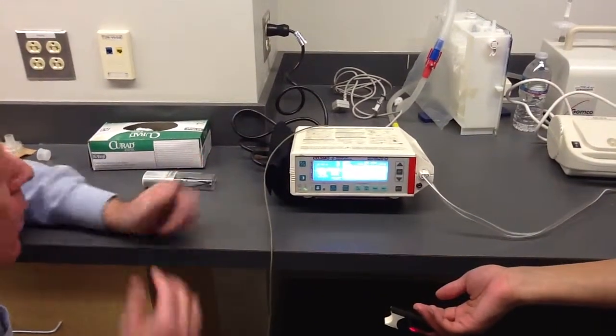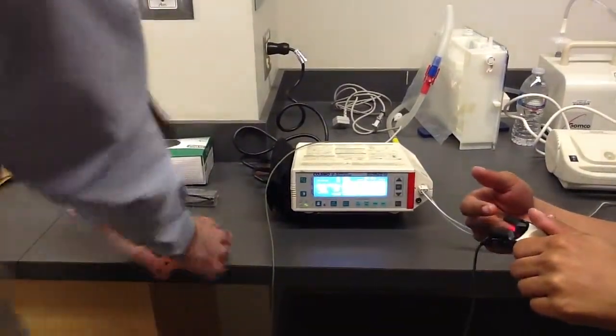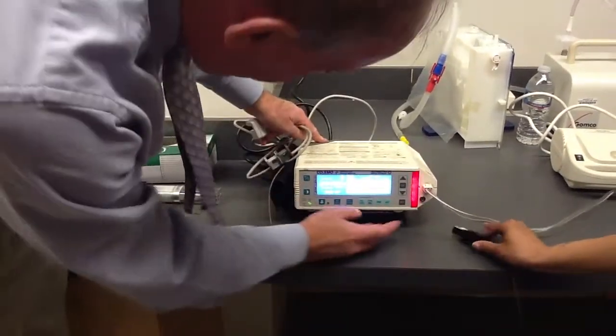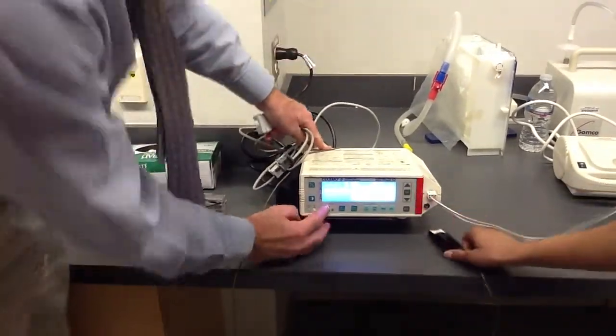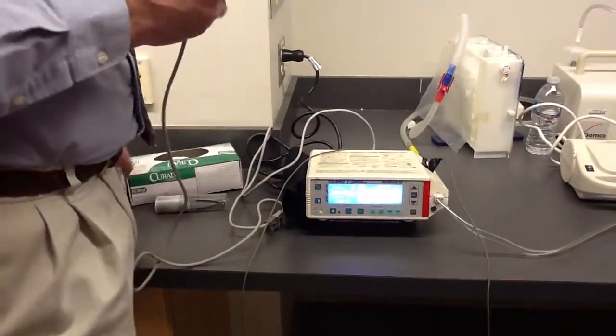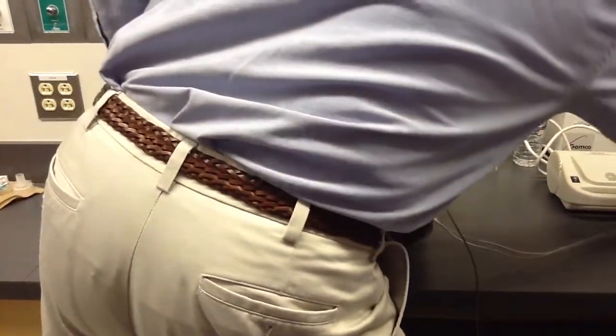Okay, are we good? Now, this machine can also act as an end-tidal CO2 monitor.